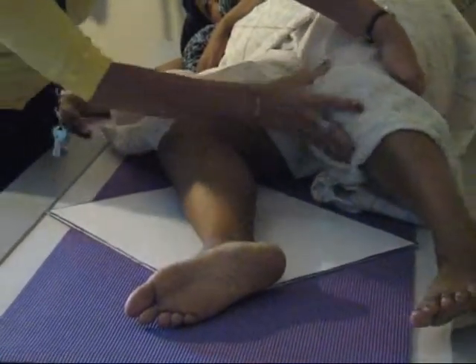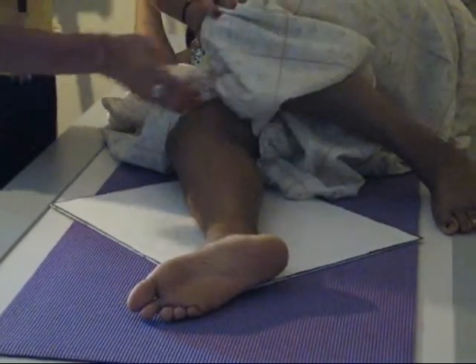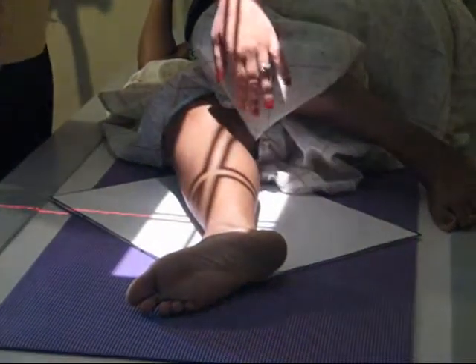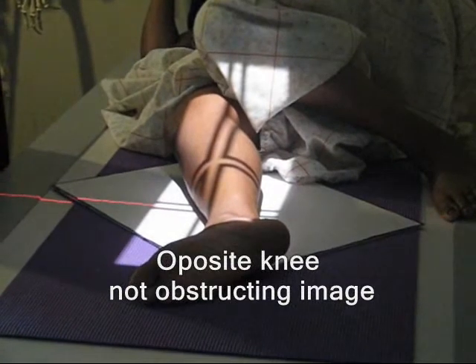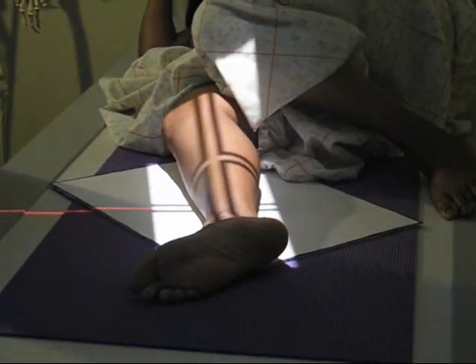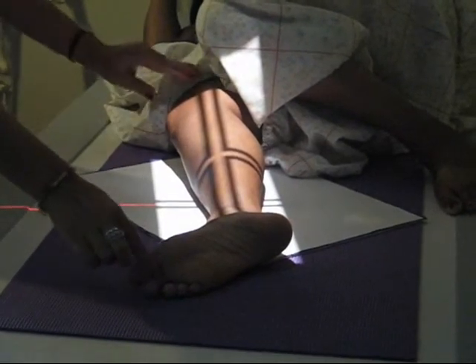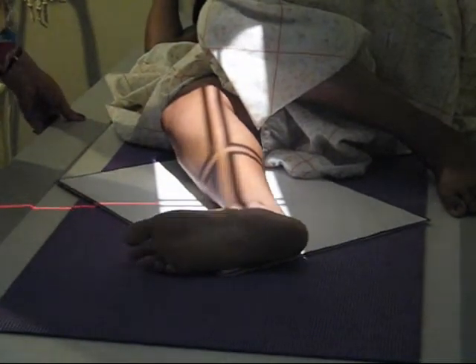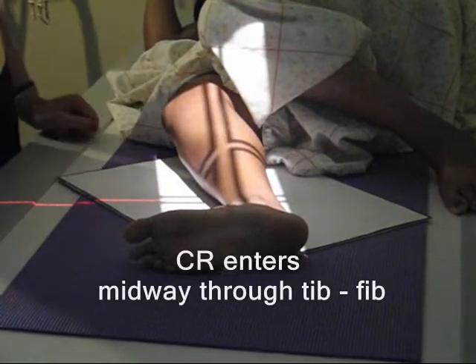You want to make sure that if she brings this one back to make a perfect 90-degree angle. Okay. Make sure that this knee is not going to obstruct the affected knee view. Again, okay, very good. And the CR midway through the tib fib.